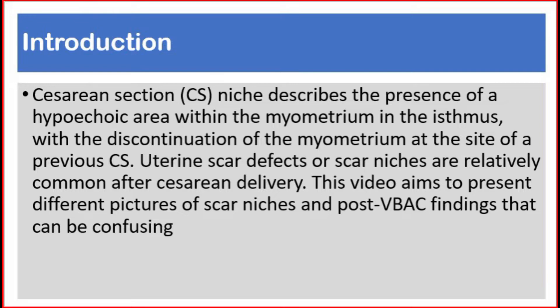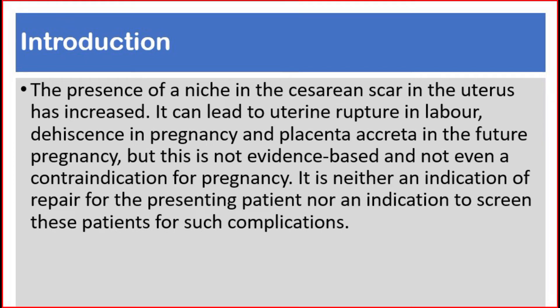This video aims to present different pictures of scar niches and post-vaginal birth after caesarean section findings that can be confusing. The presence of a niche in the caesarean scar in the uterus has increased, and it can lead to uterine rupture in labor, dehiscence in pregnancy, and placenta accreta in future pregnancy.